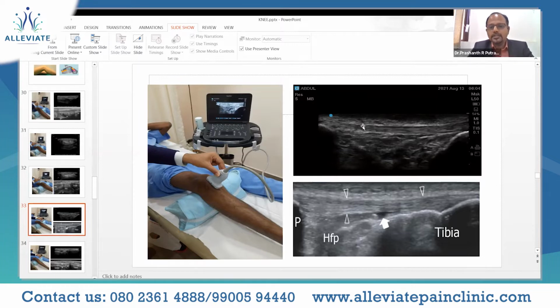This area is very important because multiple pain generators are located here, like the bursae already discussed: the prepatellar bursa, and the deep infrapatellar bursa. If there is any bursitis, you would see an anechoic collection in this area in case of a deep infrapatellar bursa, and a superficial infrapatellar bursa would be located in this area.